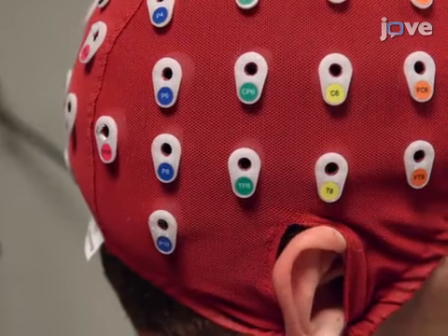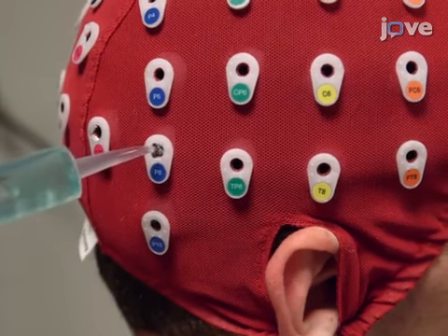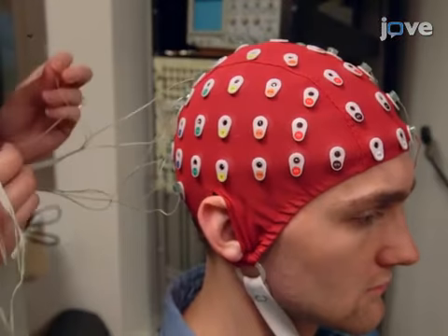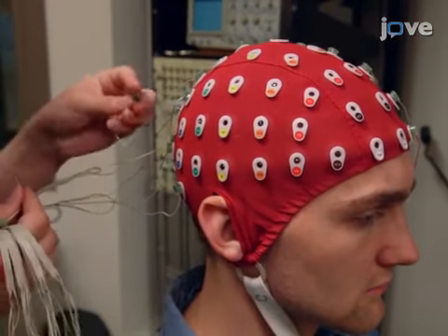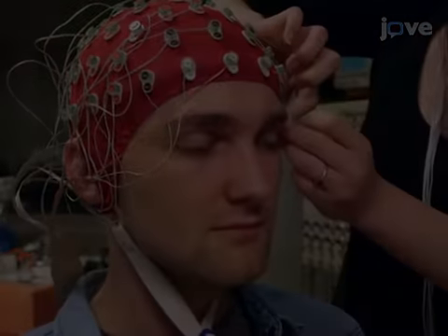Next, apply electrode gel in the electrode holders using a disposable syringe with a dull tip. Attach the EEG electrodes into the electrode holders by matching the labels of each electrode to its specific electrode holder on the cap. Then, clean the skin.